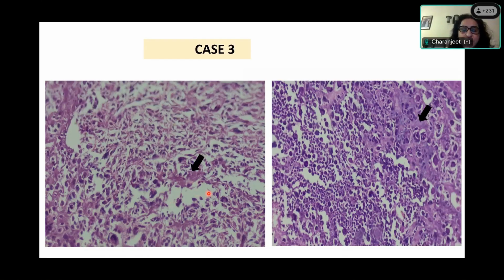This looks like osteoid here, and there are slightly chondroid areas also. The pink material here, and in this picture, looks like osteoid. It is there in many places. You can see where the laser pointer is pointing, these cells surrounding them, there is this amorphous pink material being deposited. This is osteoid. So now this is a spindle cell tumor.